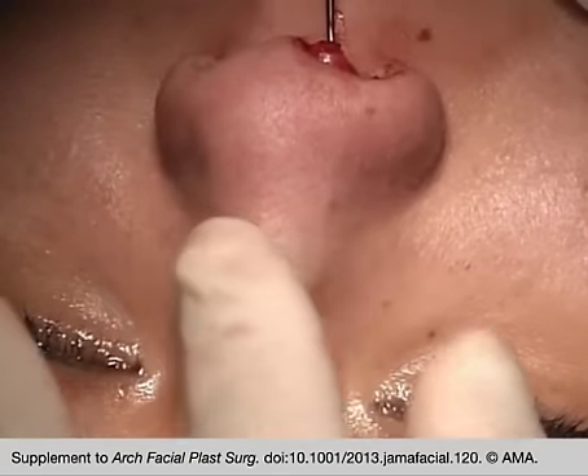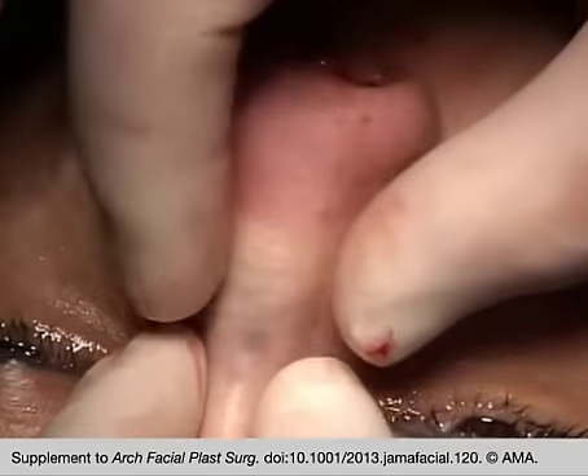When in place, the graft may be molded by compression through the nasal skin.